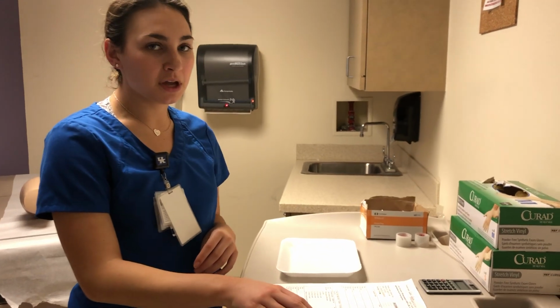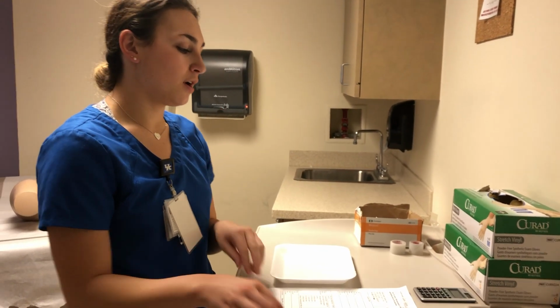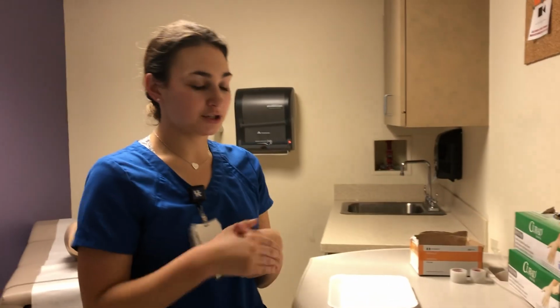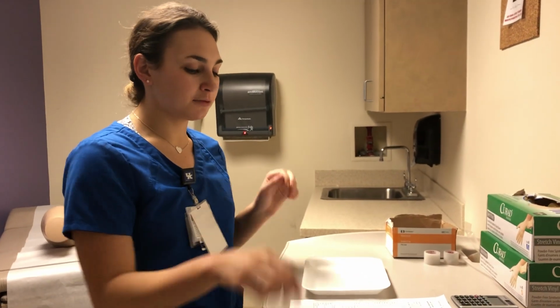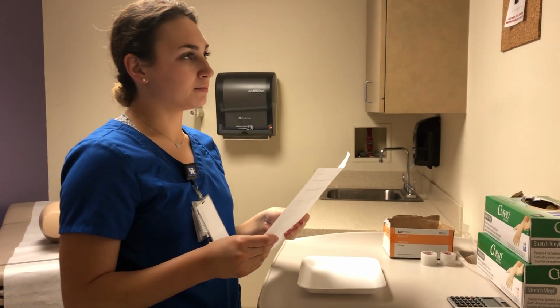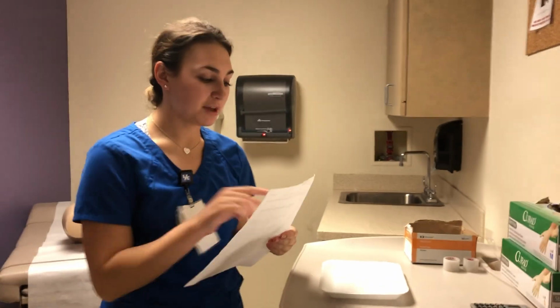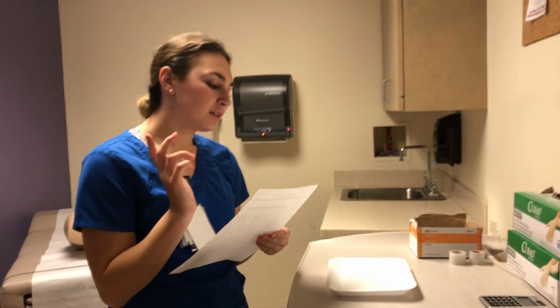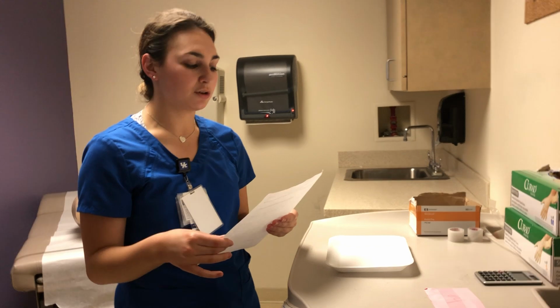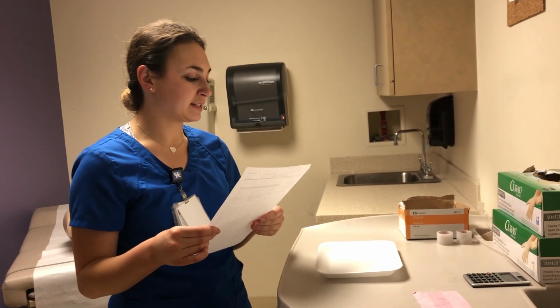So today we'll be doing a medication check and administration. So I'm going to wash my hands and then I'm going to verify the medication or the MCP order. So my patient's name is Ren Harumi. The patient ID is 160011180. The date of birth is March 3rd of 1983.